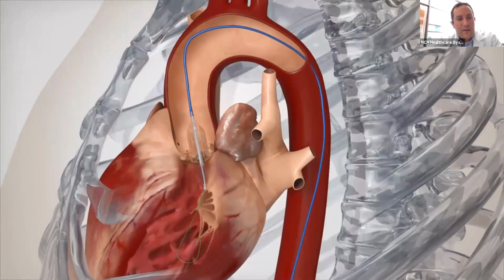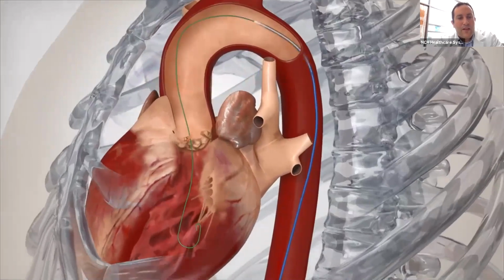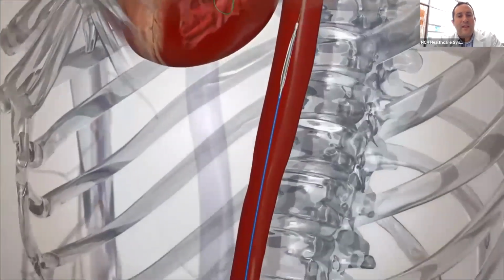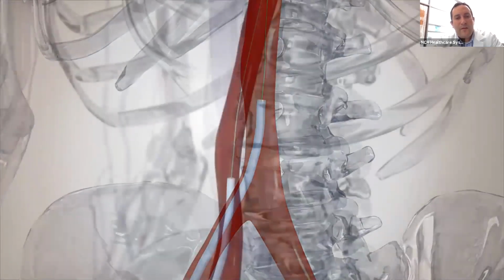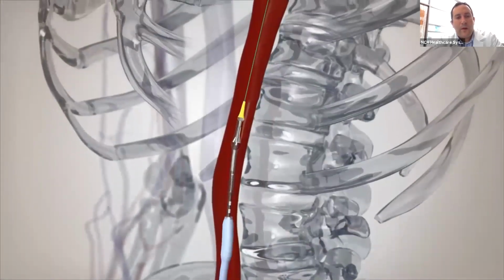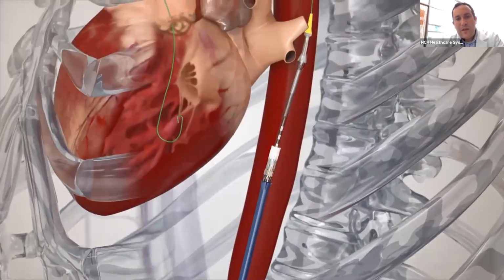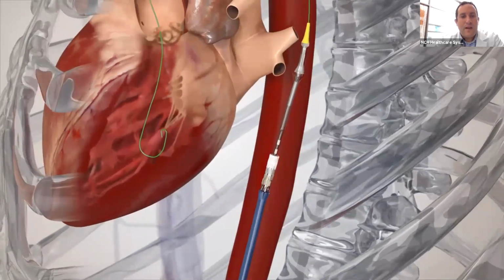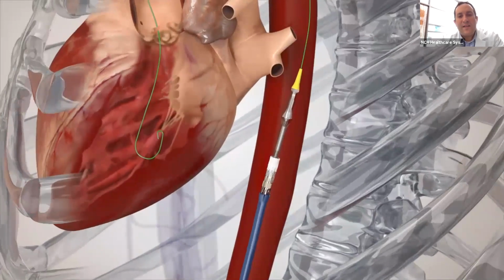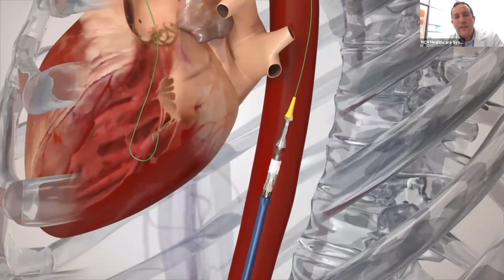We have a wire crossing into the heart. We stop the heart with a pacer, and we balloon it open. And that's simply going to help expand the valve and give us enough room and mobility to get the new valve inside there. The balloon's taken out, and over the same wire, we're going to come up with the new valve. Now, the valve cannot be placed already pre-made because it would be too big to go through the vessels. So we actually have to do this construction process inside the aorta where we pull the balloon into the valve and create the deployable valve in the aorta.